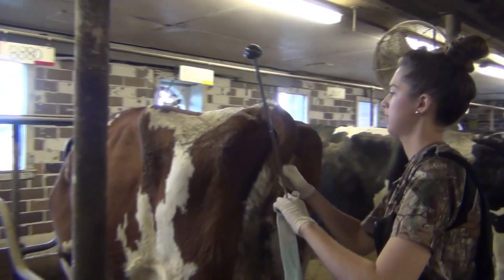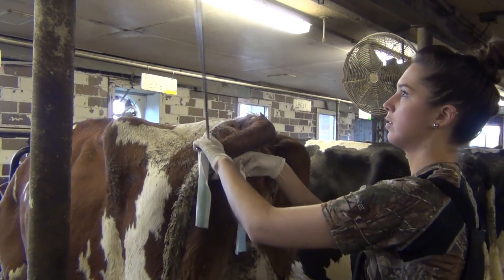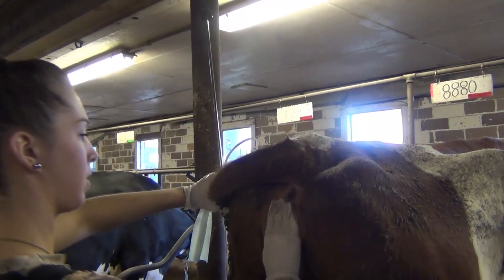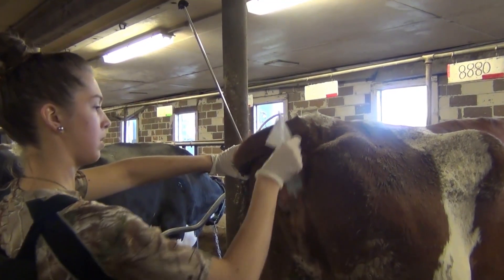With the hand holding the MetroTech device, move the tail of the cow to the side so that the vulva is fully exposed. With your free hand, clean the exterior portion of the vulva with the half of the paper towel that is soaked with Novosan solution, and then dry with the other side of the paper towel.